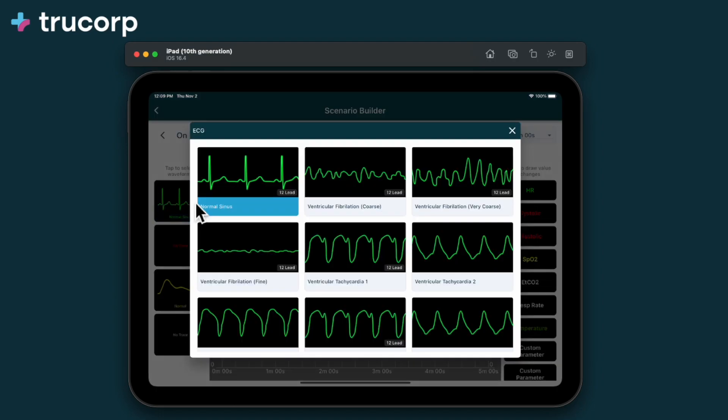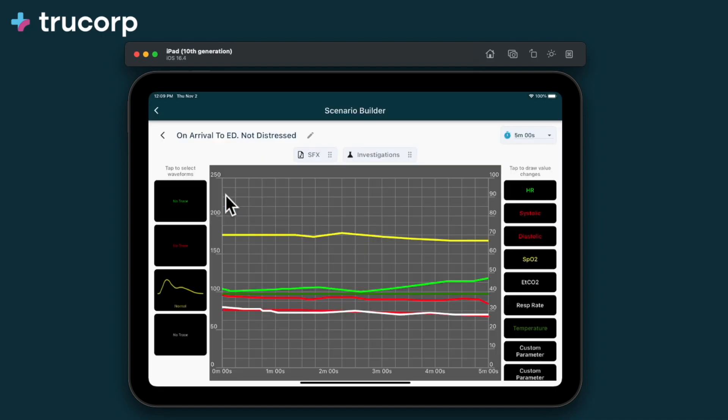On the left side, the active waveforms can be selected. These take effect from the beginning of the step.